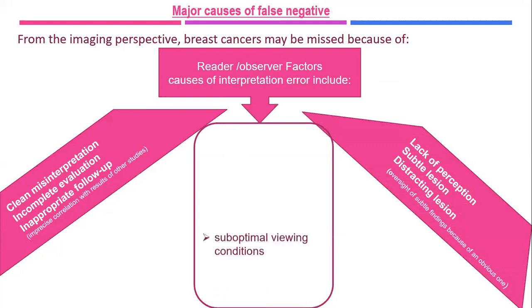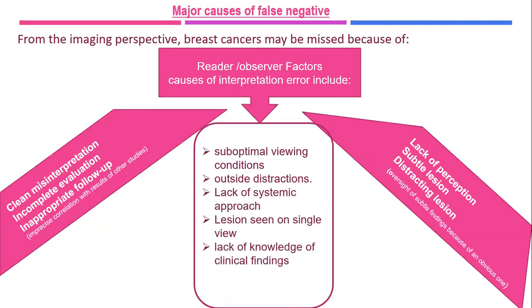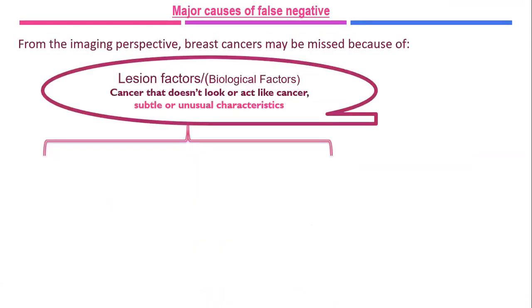These can be influenced by suboptimal viewing conditions, outside distractions, lack of systematic approach, lesions seen on a single view, lack of knowledge of clinical findings, and non-belief.